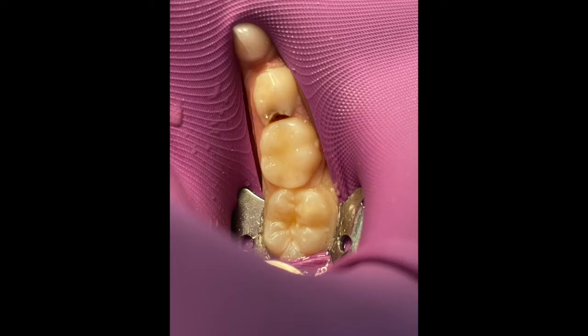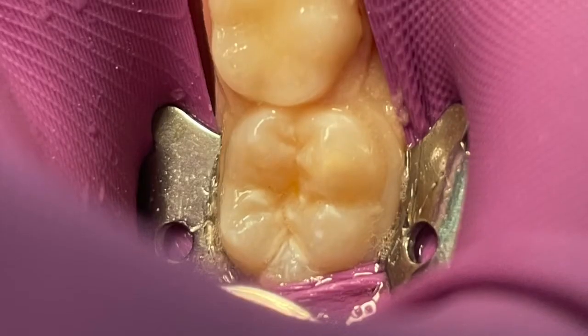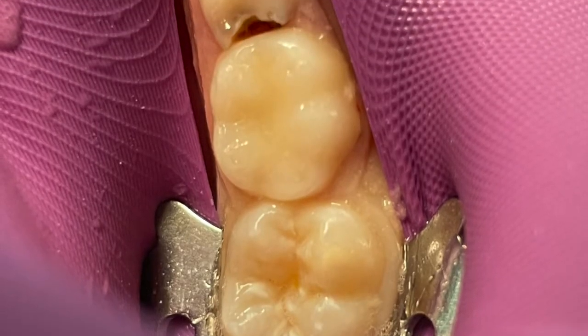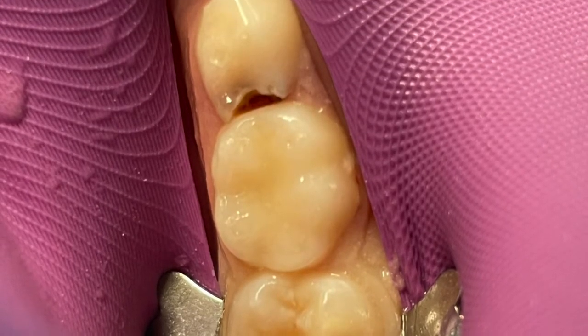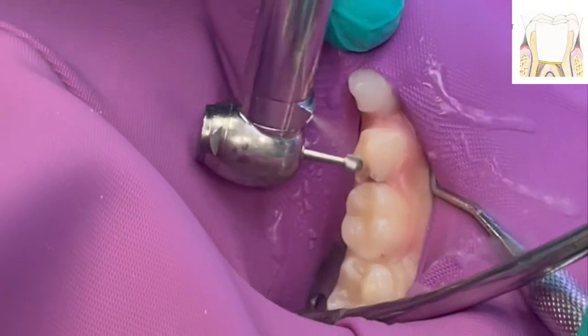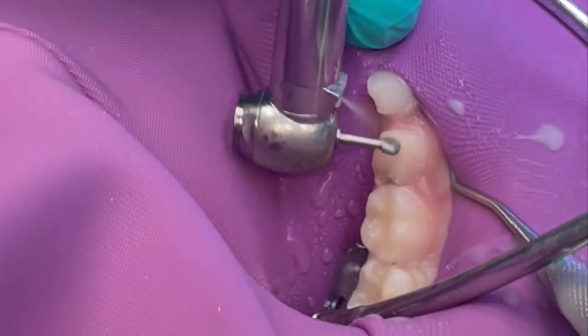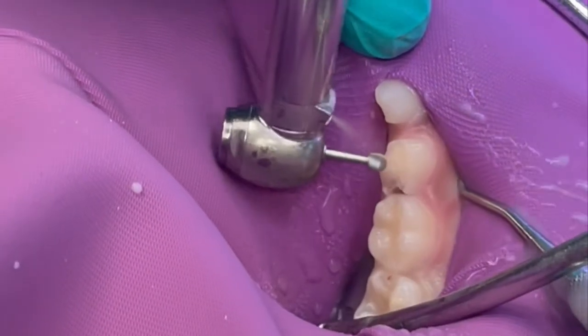Hello, today we are going to be doing a calcium silicate pulpotomy, otherwise known as MTA, on number S. These products have kind of fallen into the Coke and Pepsi scenario where MTA is kind of a catch-all phrase for any dicalcium tricalcium silicate product. We're going to be using Neoputty, a product by New Smile, for tooth number S, and go step-by-step through this procedure following the IFUs in coordination with the video — specifically for pulpotomy and apexogenesis, which is what we're doing on this primary tooth.